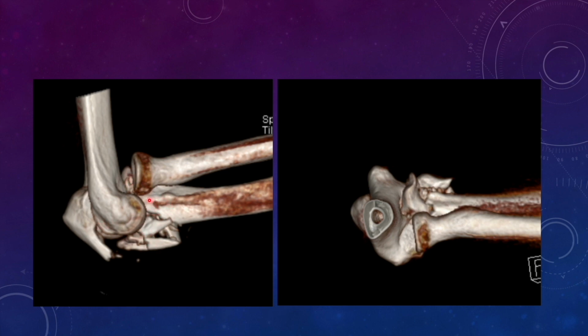And this part, I've told you, is the supinator crest, which is the area of insertion of the lateral ulnar collateral ligament. This part is intact and is in line with the remaining part of the ulnar shaft. That means the insertion of the lateral collateral ligament is intact. That's why the radial head and the anterolateral facet articulation is still maintained. That means the radial head is moving with the proximal ulna. It is not moving with the olecranon, or it is not dislocated posteriorly, because probably the lateral collateral ligament is intact.